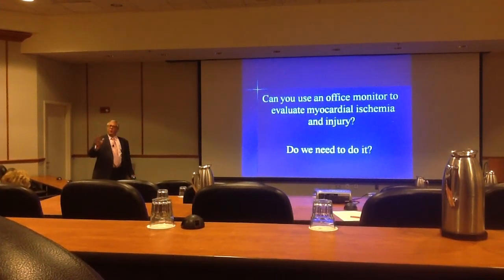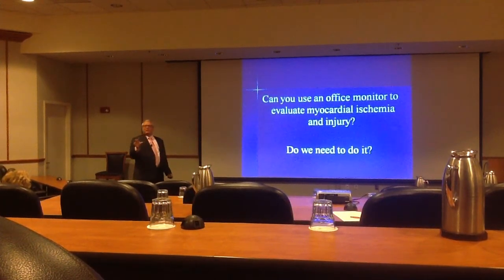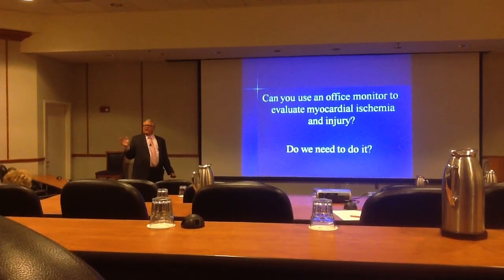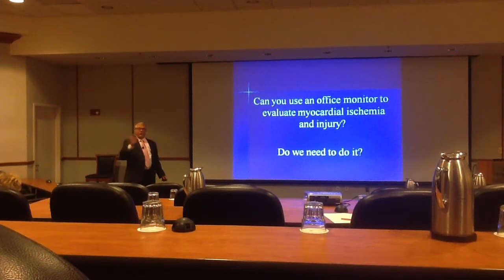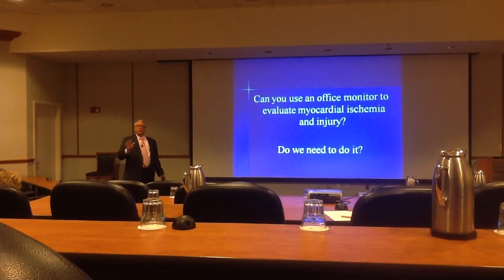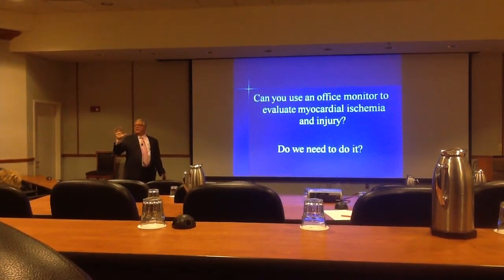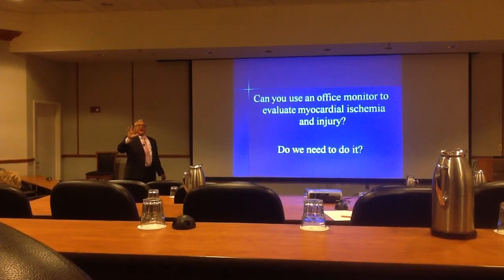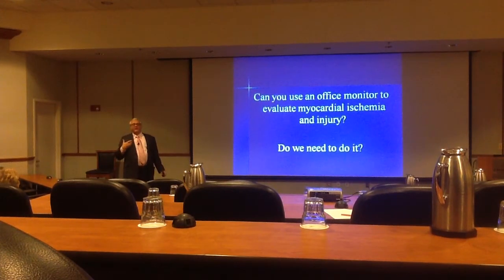But the one thing I will tell you is all these monitors that they had out there, some people say, hey, can we look at ischemia on these heart monitors? And yeah, you can. On the old monitors that we used to have back in the 80s, we couldn't because we only looked at lead 2. But all those monitors that she had out there, you can actually get 5 leads on that monitor. And you can actually put a lead on the chest to try to look for ischemia. Now, do you want to do that? My personal opinion is this.